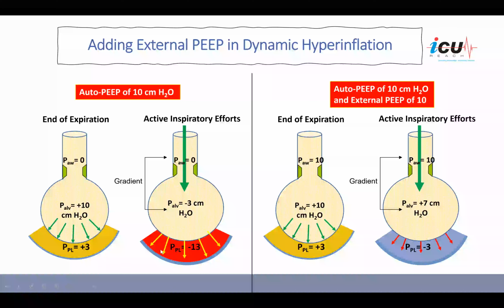compared to the case before we added the PEEP, when he needed to generate 16 centimeters of water. So this way, with adding PEEP, we did not change or improve the auto-PEEP. However, we were able to make it easier for the patient to inhale.